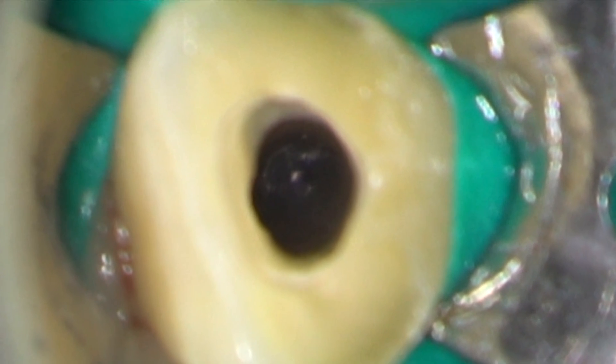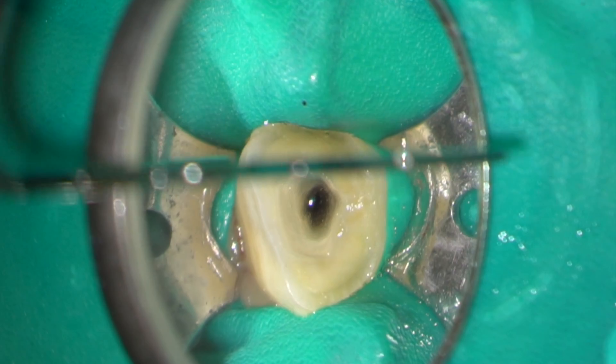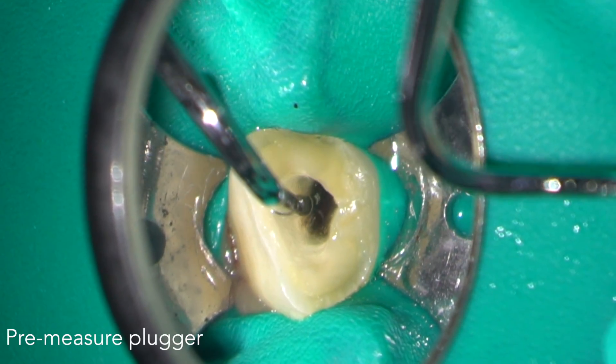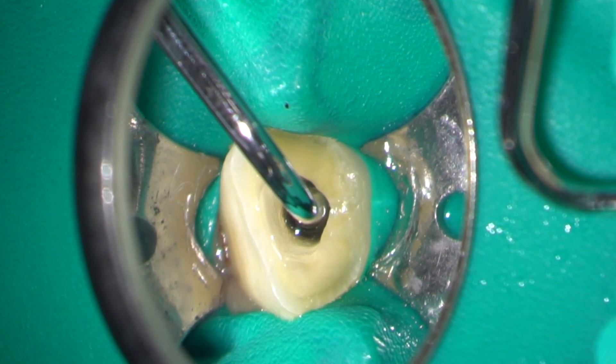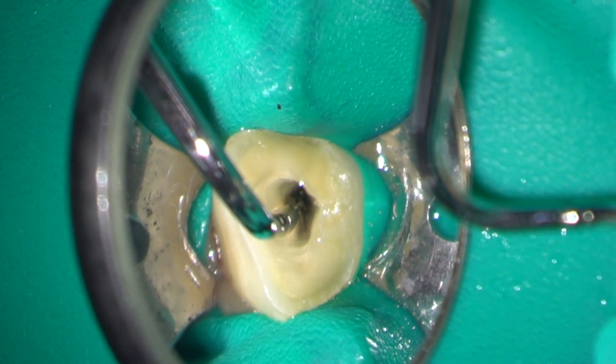Looking down the microscope at high magnification you can see right down the root canal to the apex of the tooth. The root canal length was estimated using a combination of measurements from the digital radiograph and an apex locator.